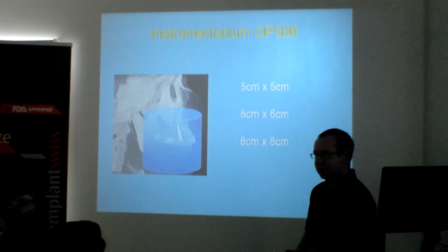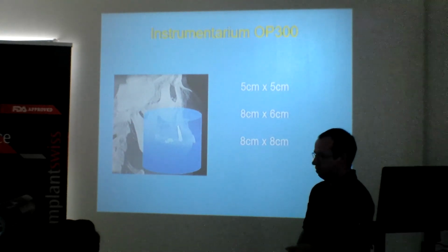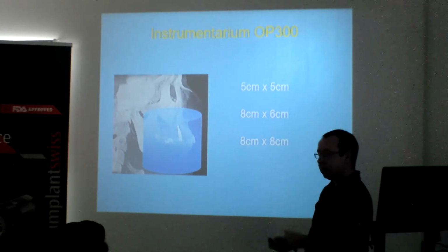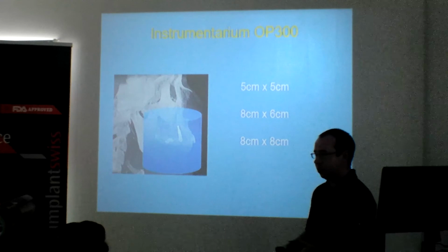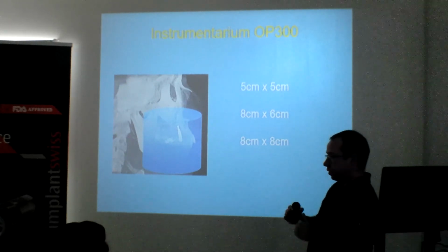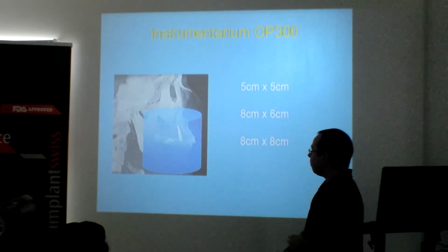And we have a rule at CTDent, and whenever we do a scan of the maxilla, we always try and get at least a third of the maxillary sinus in. The third, you mean from the alveolar crest, from the bottom? Yeah, yeah. We always try and get that in. Now with this field of view, it's not always possible. So sometimes if you have a both jaws scan in one of our centres that has this particular scanner, you'll find you'll get 2 scans back from us purely for that reason, because we want to get the full anatomical area on for you. This field of view can also be used for imaging the sinuses as well. So effectively you raise the actual field of view up on the scanner, so you raise the gantry up, so you can include the full maxillary sinuses on this as well.